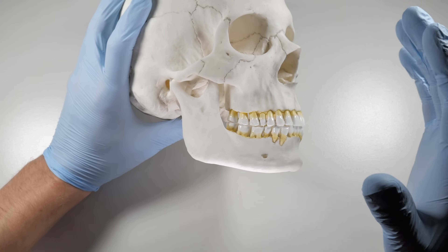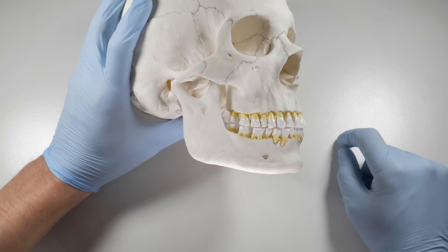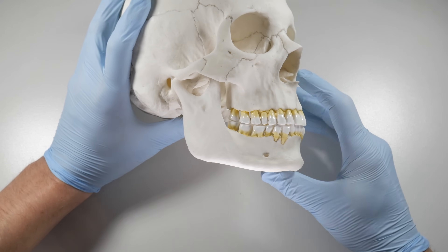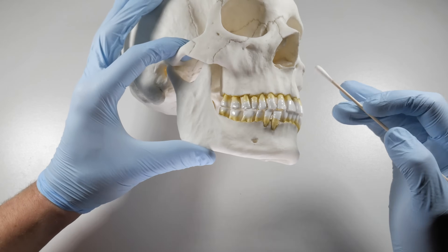The PSA is a terrific block — it has become one of my favorite blocks now that I've learned the proper way to do it. We're going to go over that technique right away, and we're going to start with showing you how to find your insertion point.